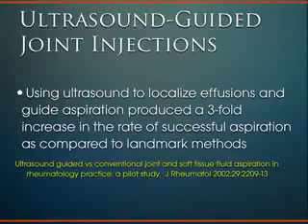It is really very, very useful because again it's real time. You're not using fluoroscopy, which is kind of a typical modality that guides injection treatment. But it's radiation exposure for not only the patient but also the practitioner who's doing it all day. You can't wheel the fluoroscopy machine in and out of all the rooms, and ultrasound guidance is very, very nice, very dynamic, and very useful.